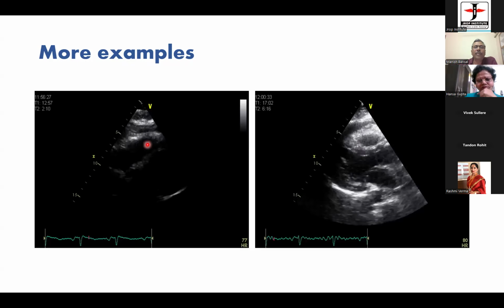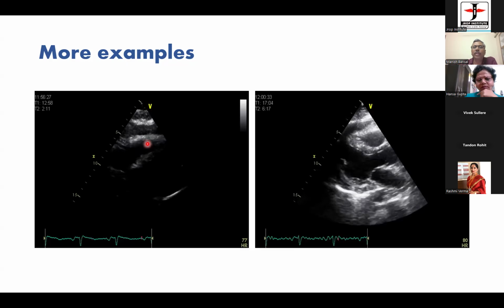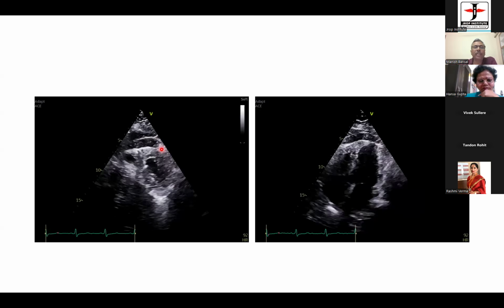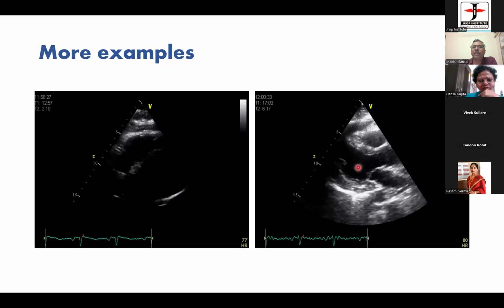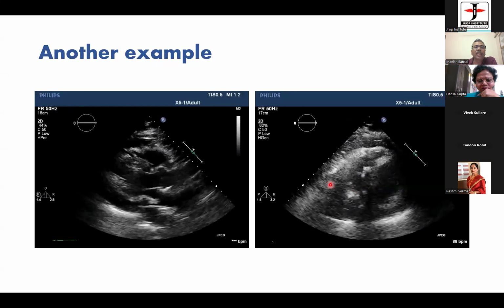First is that pericardial effusion is generally anechoic, as you had also mentioned. It is echolucent. In comparison, epicardial fat almost always has echogenicity, these granular appearances, because it is not fluid, it is fat. So there is some tissue there, which gives this echogenic appearance. So in this also we can see there is echogenicity. Here also there is echogenicity.